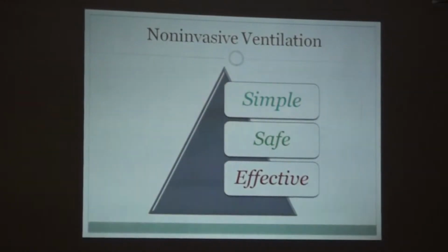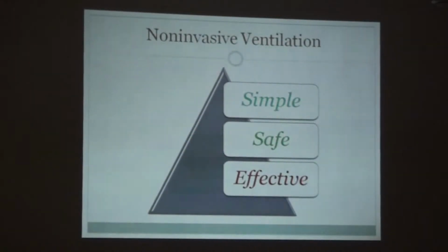Invasive ventilation is endless. Most commonly, ventilator associated pneumonia, with malnutrition, with patient discomfort, use of sedatives and muscle relaxant. So it is very safe if we can use non-invasive ventilation, and we can prevent invasive ventilation. Yet it is very effective, as we can see. So we should apply this non-invasive ventilation whenever the situation demands.